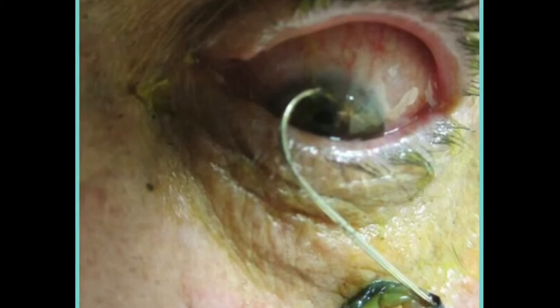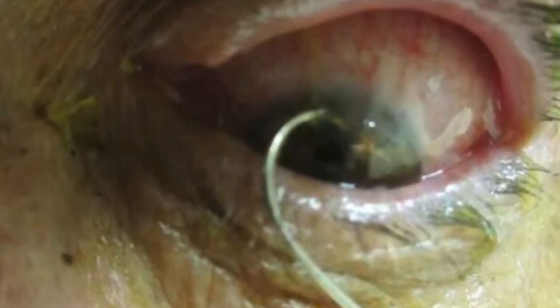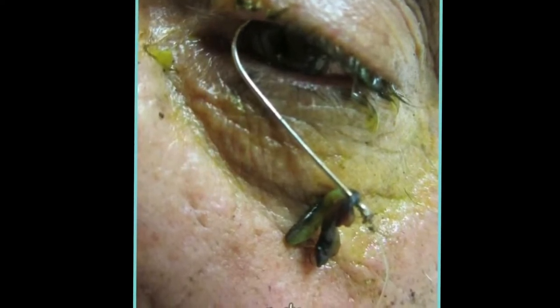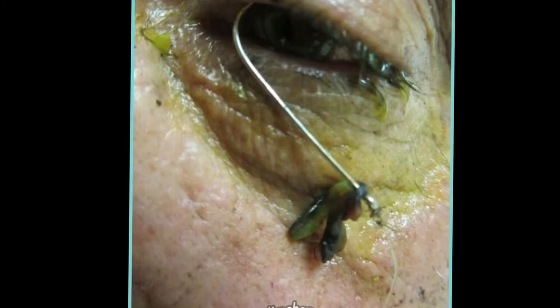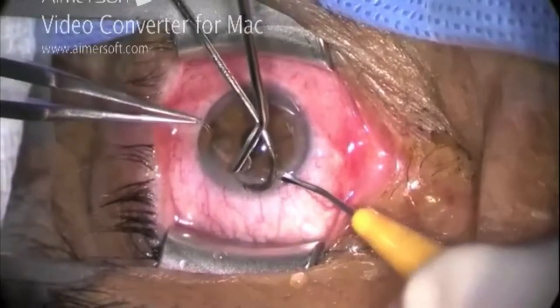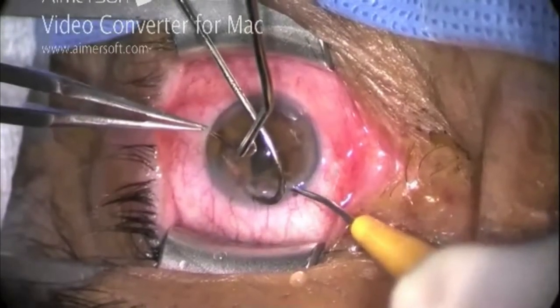The first thing I noticed was how that barb was laced through the actual fibers of the iris — actually, I'd be lying if I told you that, because the first thing I noticed was this little guy still hanging out on the end of the fish hook. We went straight to the OR where the first order of business was to remove the worm from the hook and get started on removing the hook safely.